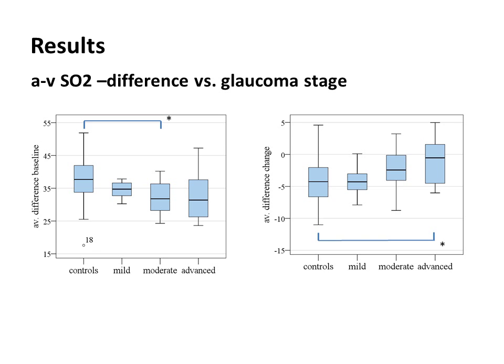You have to keep in mind that these are negative values, so that's why it looks like an increase, but in fact it is a decrease of the AV difference change.